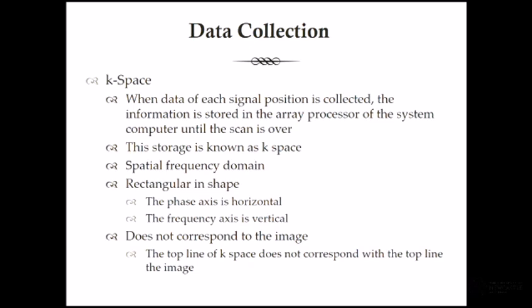That information in K-space gives us an image. If we get an artefact in that K-space, it impacts not just one slice, but the whole data set, which is why when you're doing MR imaging, if someone moves during the acquisition, it can toast the whole imaging run. Whereas on CT, you might do an imaging run and they move for one slice, you can go back and repeat one slice. That's not the case with MR because all of that data in K-space contributes to the image because it's got frequency information in it.